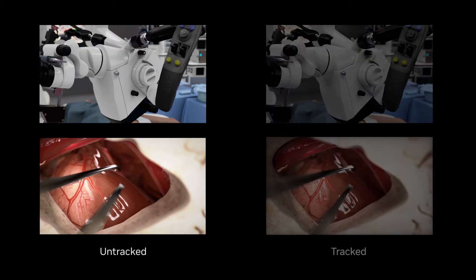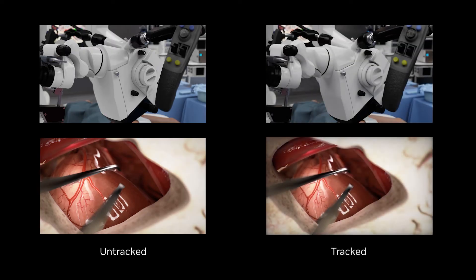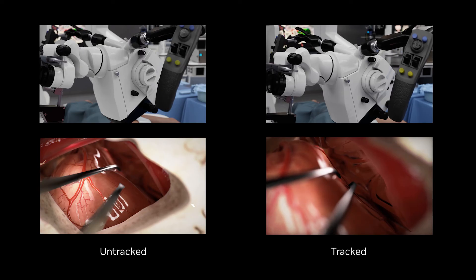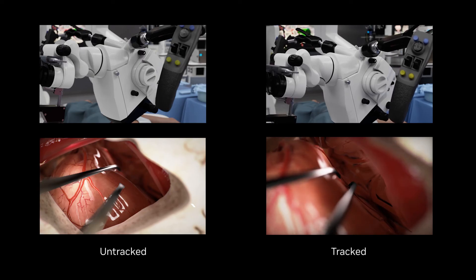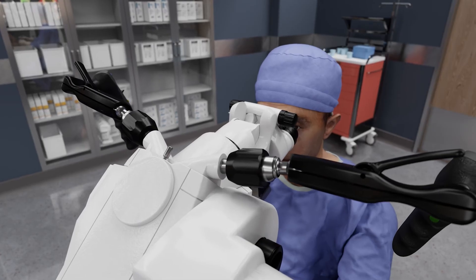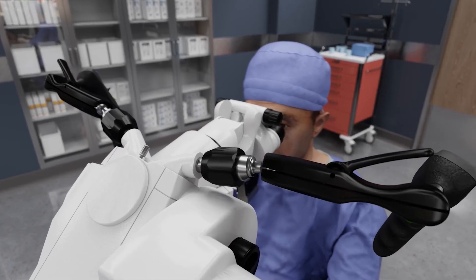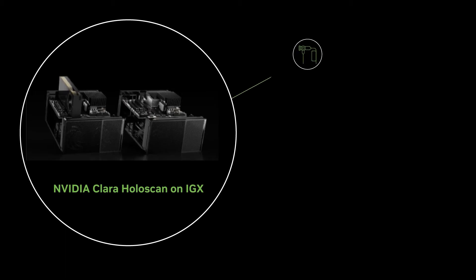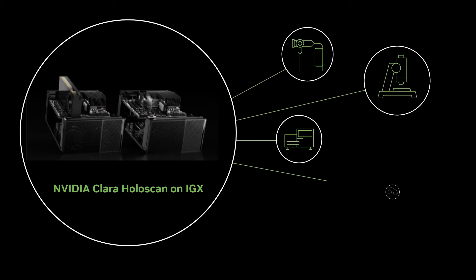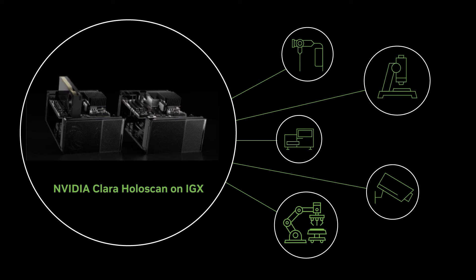Without AI tracking, the microscope will not maintain alignment with the surgeon's tools. With tracking, the IGX platform automatically tracks the position of the surgical instruments and controls the real-time movements of the microscope. This can reduce the patient's time in the OR and improve surgical efficiency.